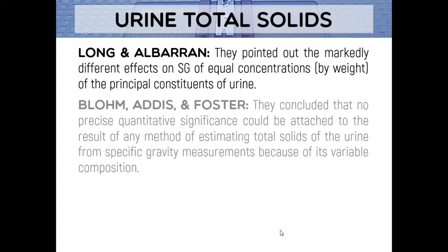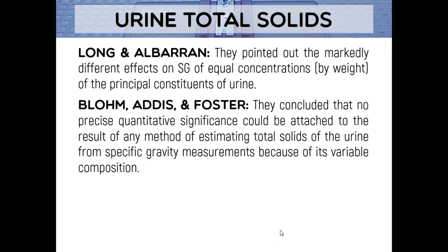Albaran. And according to Blom, Addis, and Foster, you cannot derive a precise quantitative significance, no matter what method you use to estimate total solids from the SG, because the composition of urine is highly variable.